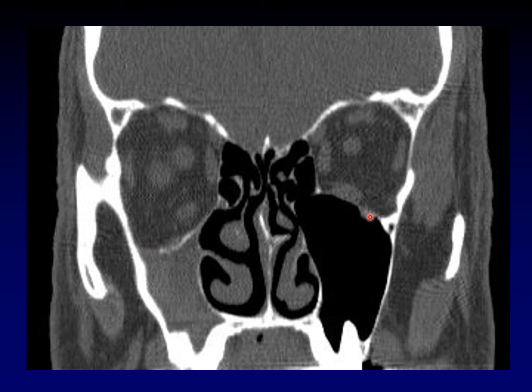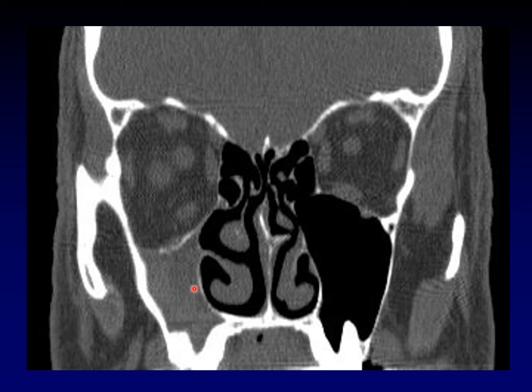You can see on the unaffected side the normal configuration of the orbital floor, and on the affected side how it has been drawn down. This artificially increases the volume of the orbit — the eyeball falls back and you get enophthalmos. Enophthalmos as a result of chronic sinusitis and retraction of the orbital floor is called the silent sinus syndrome, and you can make that diagnosis easily on CT.